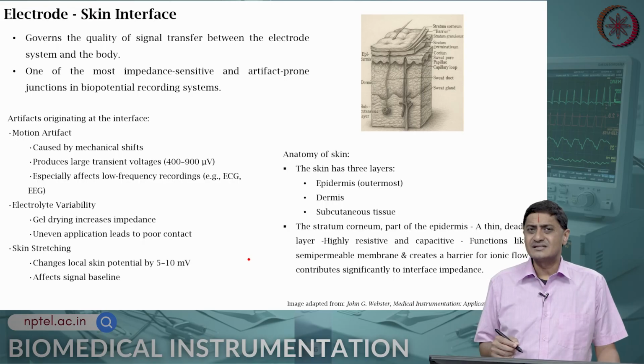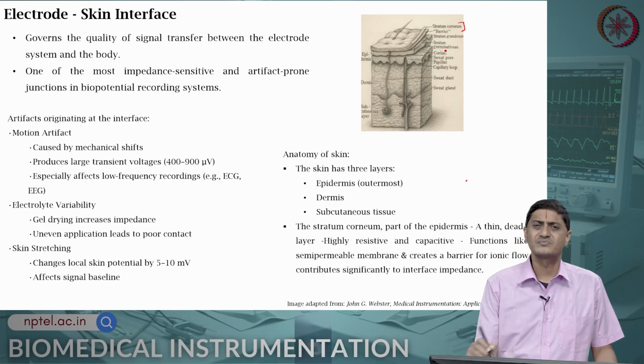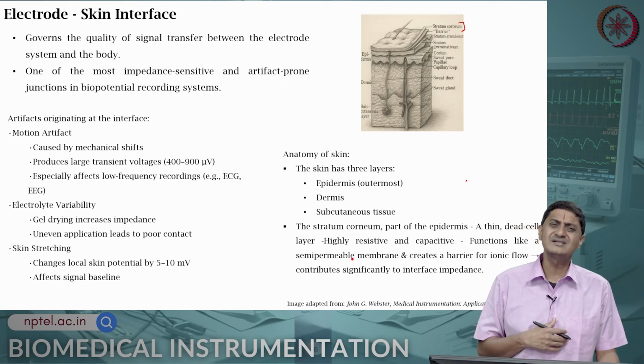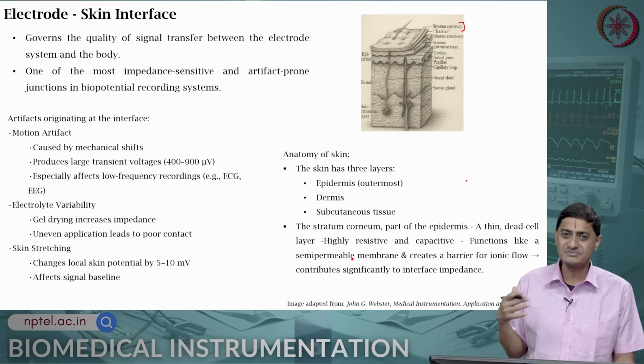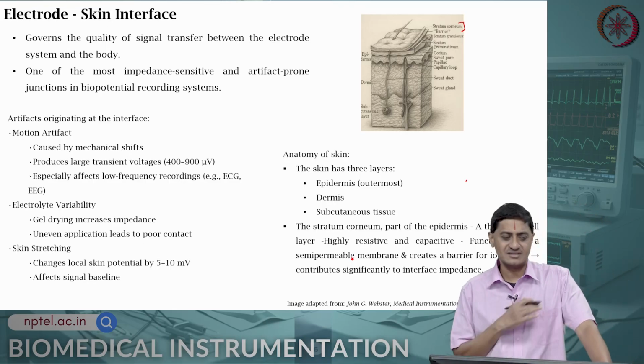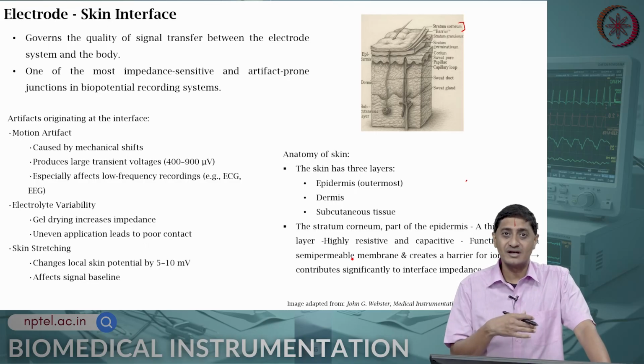First, skin has many layers. The topmost skin layer is called the stratum corneum. Stratum corneum is a barrier. It is essentially composed of dead skin cells. This is what gets washed away when we bathe. When we shower or bathe and when we scrape, these are the dead skin cells that die off, and they keep getting regenerated, perhaps every day once.